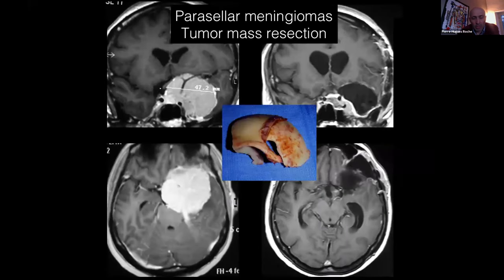Here, this is a cytoreduction I showed you. Usually I use this kind of modified FTOZ approach because the tumor is growing upward. And in this case, it makes sense to do this FTOZ, removing in one piece only the orbital roof, but this is not a complete full FTOZ. This is a half of the FTOZ. This is one block. I like this approach, but I use it really confidentially in case of very large tumors.